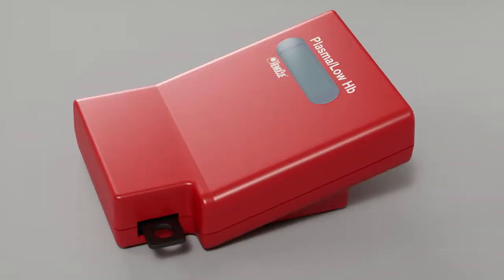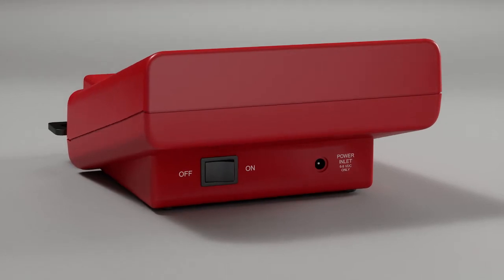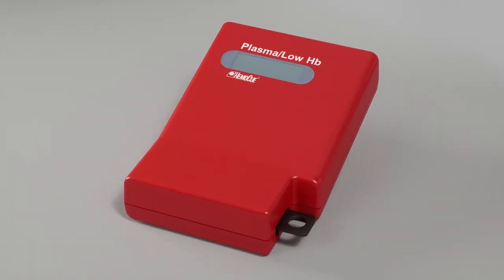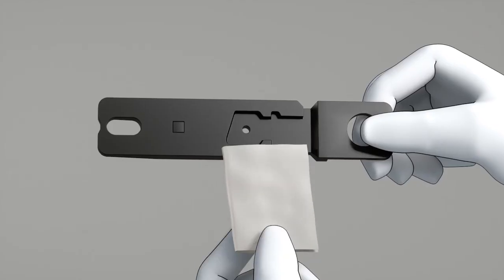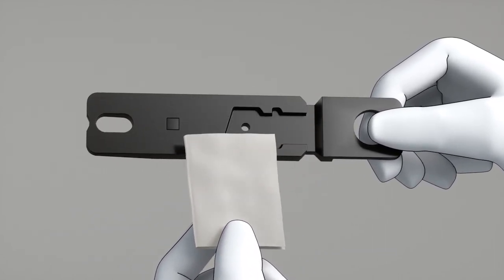Turn the photometer off by pressing the on-off button. The cuvette holder should be cleaned after each day of use. Pull out the cuvette holder from the photometer. Clean it with alcohol, 20 to 70 percent, or with mild detergent.